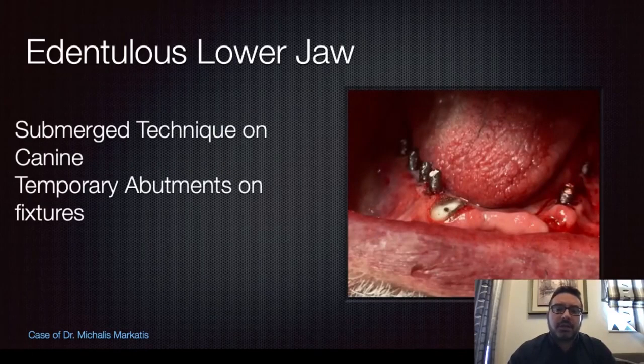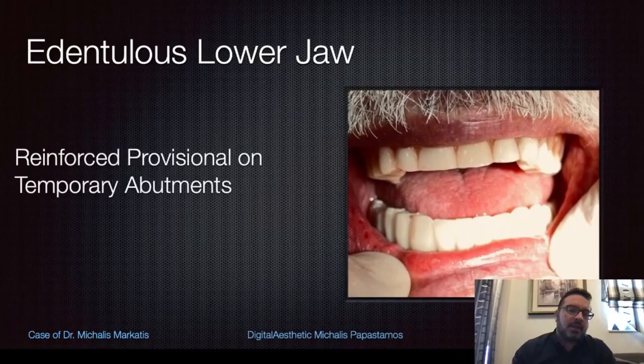And here are the provisional, the temporary abutments, already trimmed from the lab. And as you can see, we didn't extract it. The dentist decided not to extract the canine, but use something like the submerged technique to have more stability to the bone and to preserve the mesial bone of the implant that is next to the canine. And after that, we proceed to the provisionals.